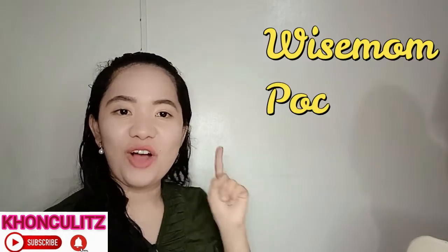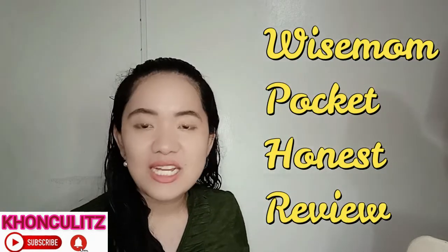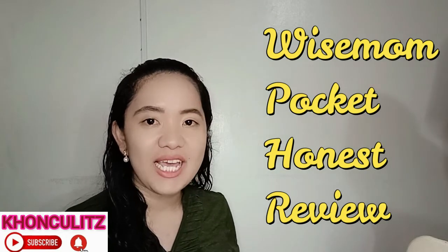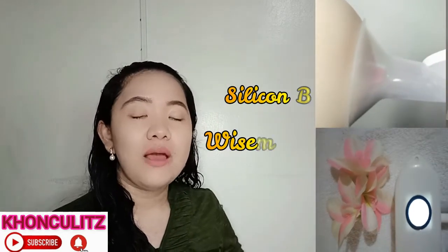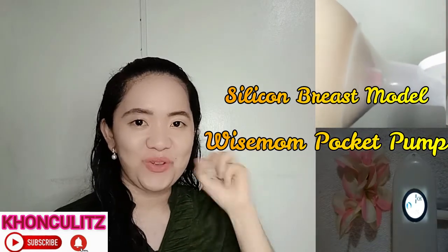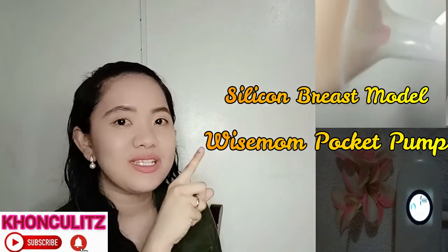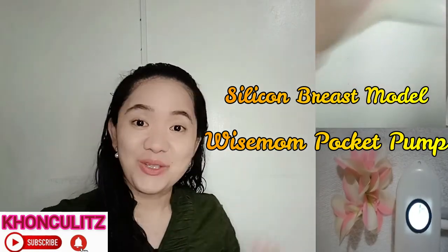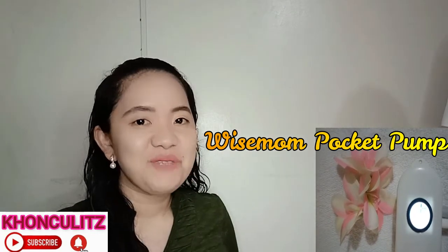Hi mommy! So we are now up for another vlog. This time we are going to have an honest review on Wise Mom Pocket. I am also going to show you its suction level based on its mode — massage mode and expression mode — and a demonstration of its actual suction. So come on, let's see the performance of Wise Mom Pocket.